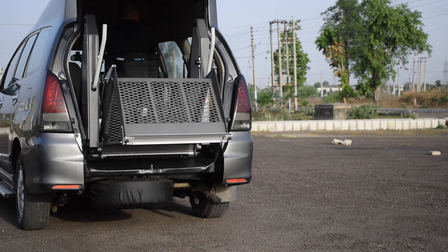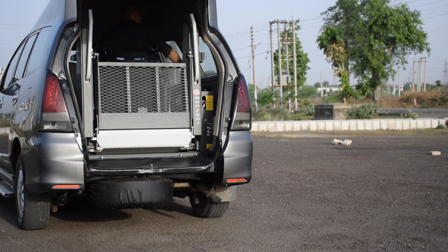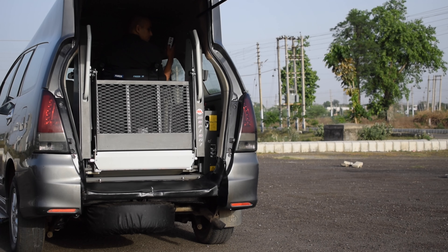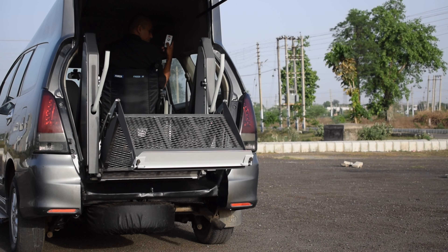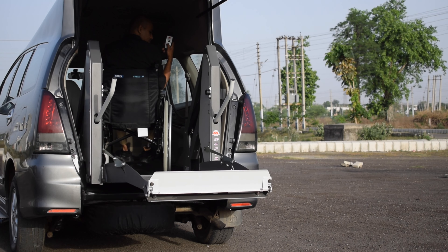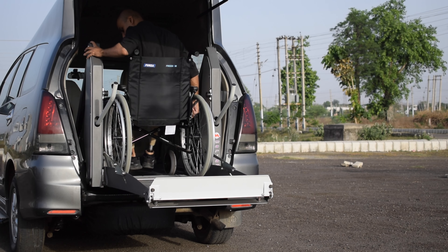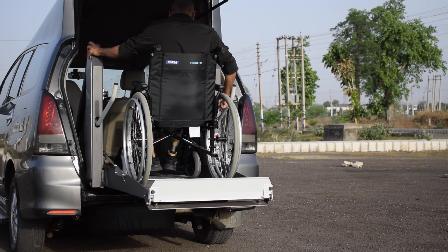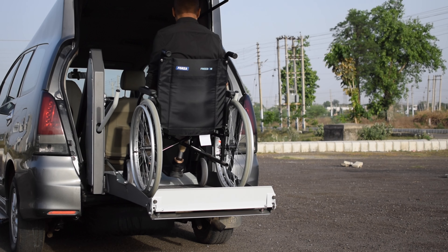The project of this modification with electro-hydraulic lifting platform has been conceived to enable the transportation of persons with walking disabilities and in particular, an easy access to vehicles for those who are on wheelchairs. This whole modification with fabrication work and a lift helps a wheelchair user to move more independently in terms of their travelling and transportation. With minimal to no assistance, you can get in and out of the car effortlessly, which is extremely beneficial for people who face issues while shifting from their wheelchair.